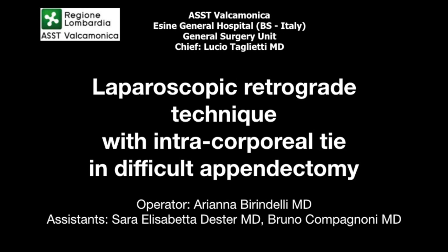Laparoscopic retrograde technique with intracorporeal tie in difficult appendectomy.